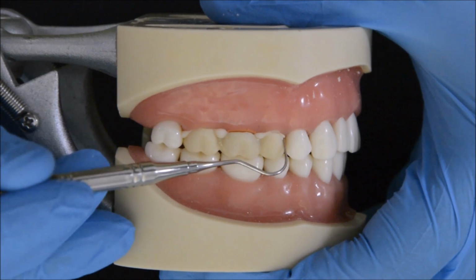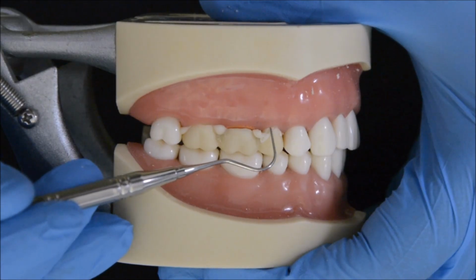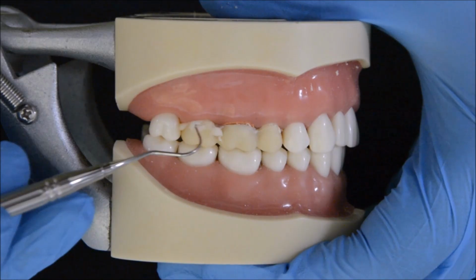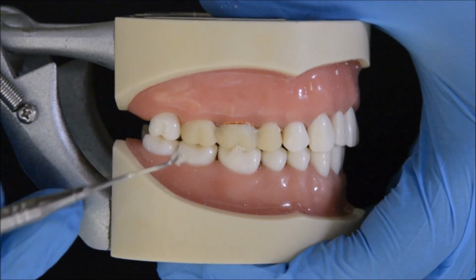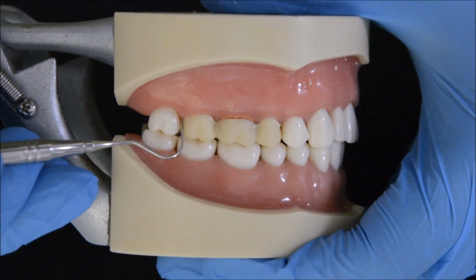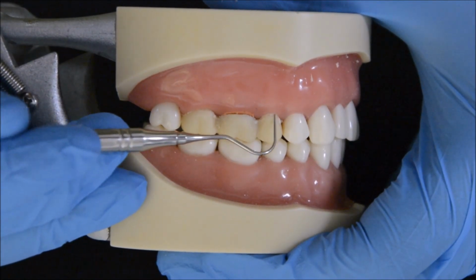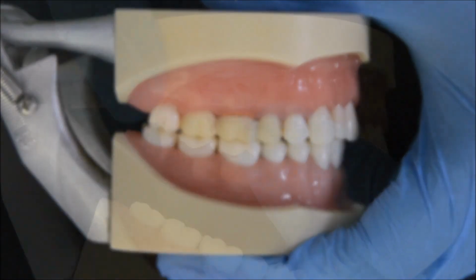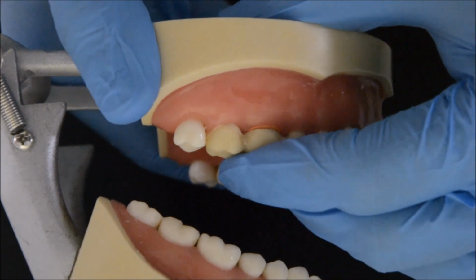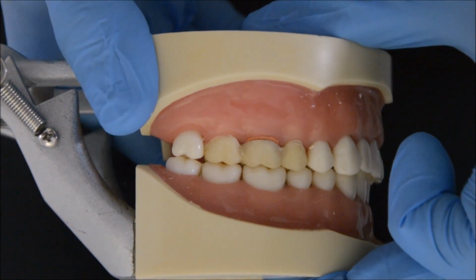Keeping the teeth occluded, the excess is gently removed using a curved explorer. Ensure removal of the excess in the interdental areas to avoid locking of the provisional against the adjacent teeth. The provisional is partially removed and placed back in a to and fro motion to ensure that the acrylic does not lock in any undercuts during its setting.